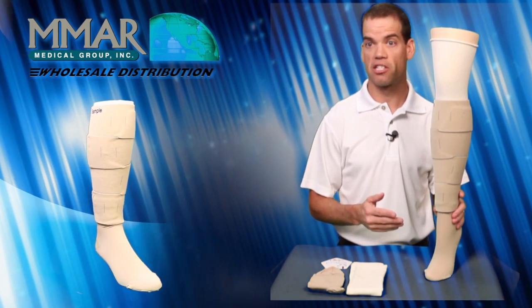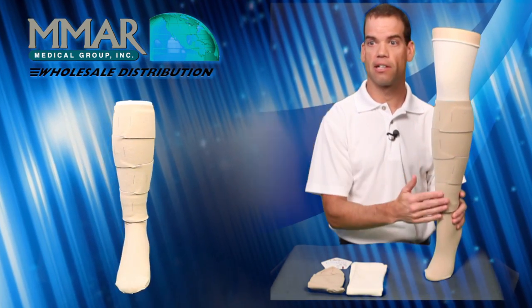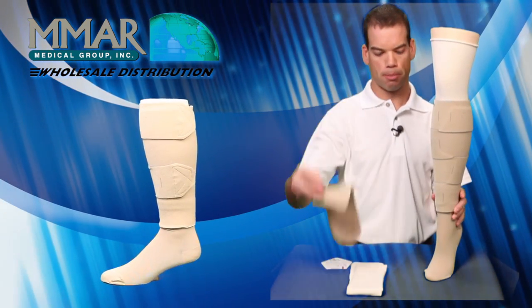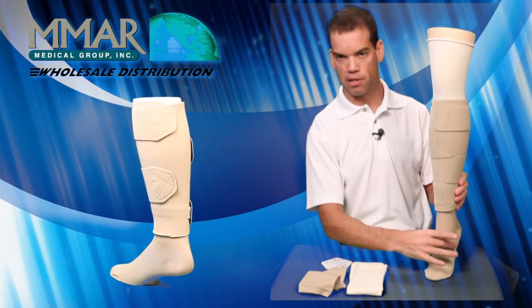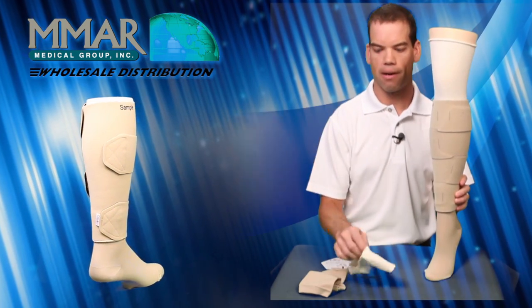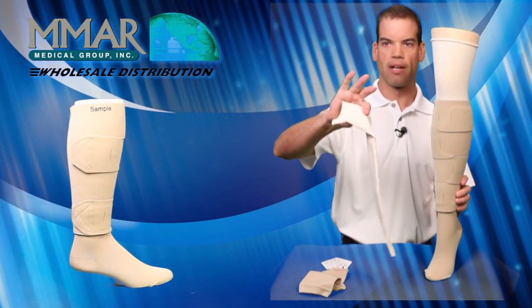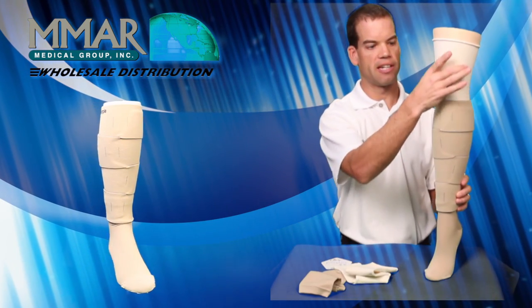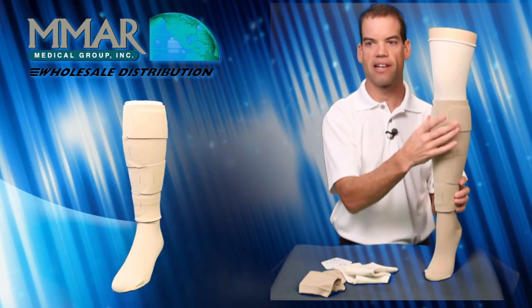What comes in a package for the Juxtalite is the actual Juxtalite itself. You get a pair of compression anklets which provide compression around the foot, as you can see right here. There's also a comfort leg liner which contains silver, making it antimicrobial, and you can see it is underneath the Juxtalite here.